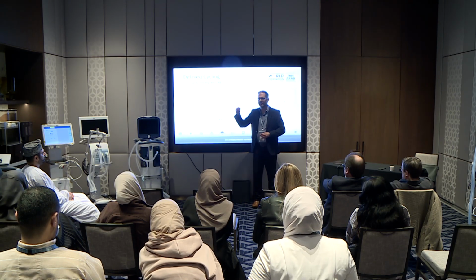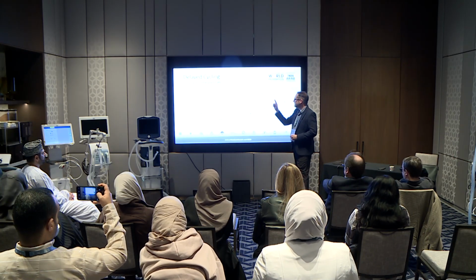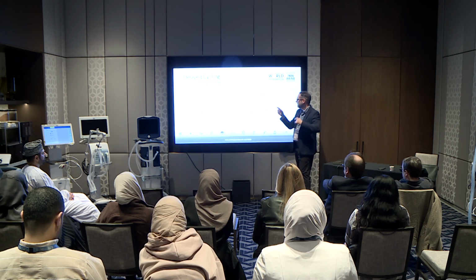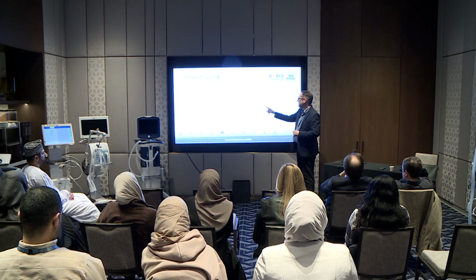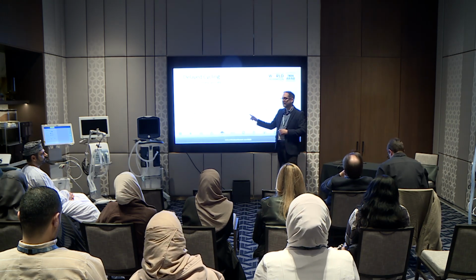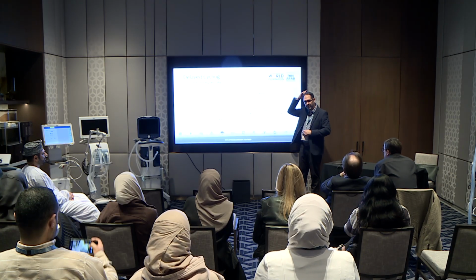Volume is the integral of flow and time, so you get extra volume. So delayed cycling not only increases your I time beyond what you want neurologically, it means you basically have an I:E ratio problem. Less expiratory time means less lung emptying. You end up with dynamic hyperinflation and auto-PEEP, which starts to cause a trigger delay, increased trigger workload, and then non-triggered breaths.